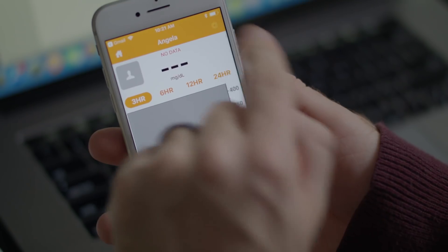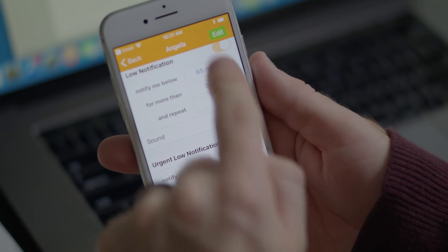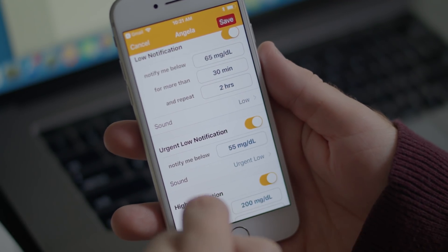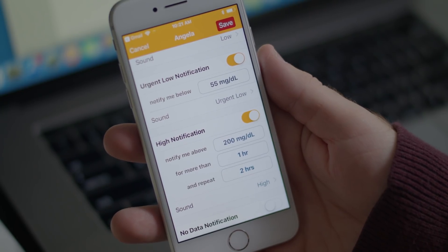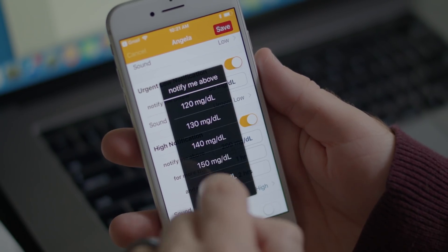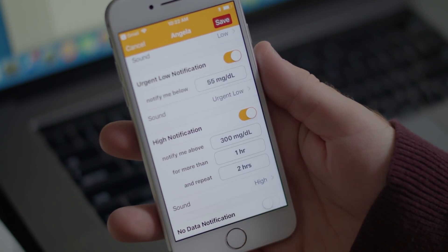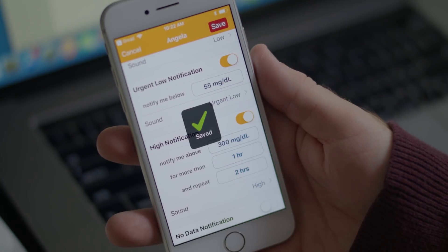He automatically gets the settings I set for him, but he can go into settings and change them at any time. This only changes his settings — it does not impact the alerts I get on my app. Tap Settings, then tap Edit and change notifications as needed. For example, if he wants to be notified when I'm over 300, he can set a high notification. The only thing the follower can't change is whether they see the sharer's trend graph. I set the app so he can see my trend graph, but if I had not, he could not turn that on.